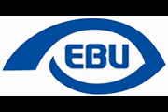Once you have the Braille display connected, there are some more settings to check and to make them work as you wish. Mostly there are languages, which language or Braille code you prefer for input and output of your Braille display. And then there are very few advanced settings you can customize, such as the rate of cursor blinking and automatic scrolling and so on.